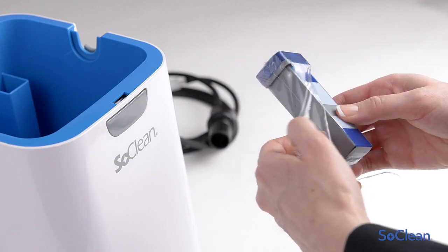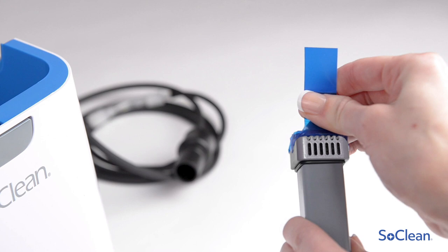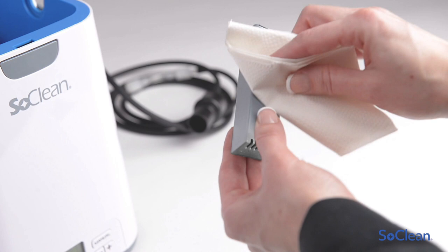Remove all protective plastic and tape from the new filter. You may see some black particles on the filter or on your hands. This is normal from the settling during shipping and can be wiped off.